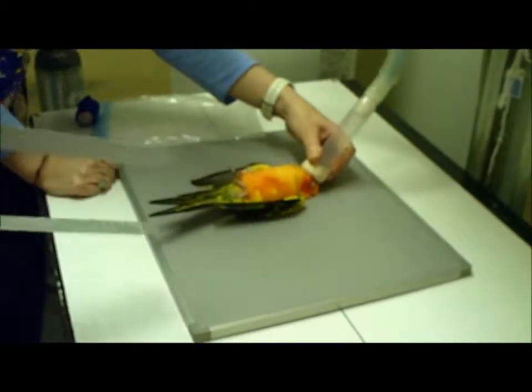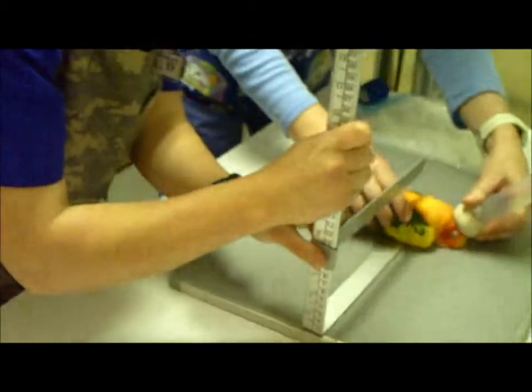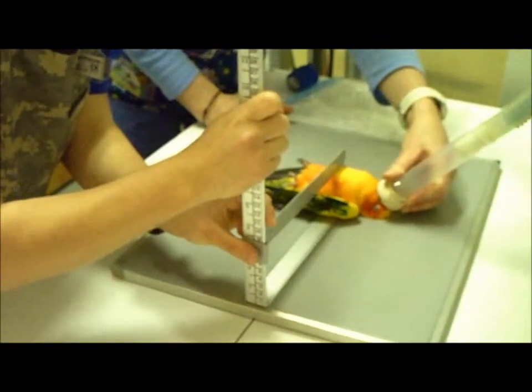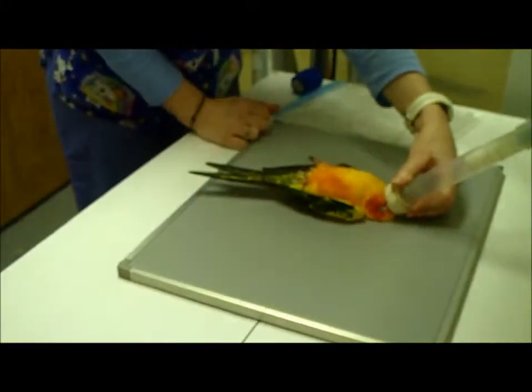This video is going to be showing the proper positioning for the avian radiograph. We're going to be doing both the whole body ventrodorsal view and the whole body lateral views.